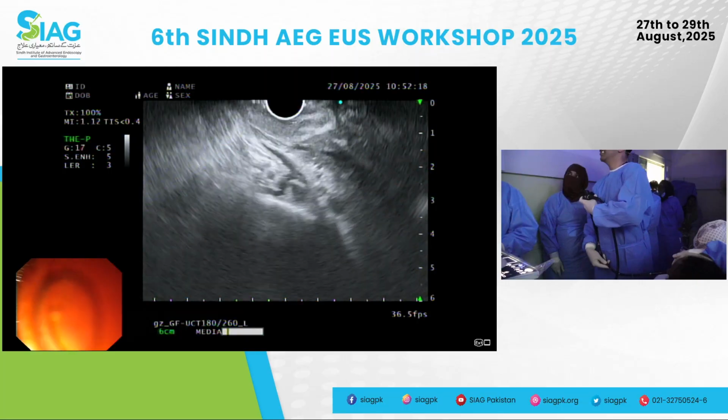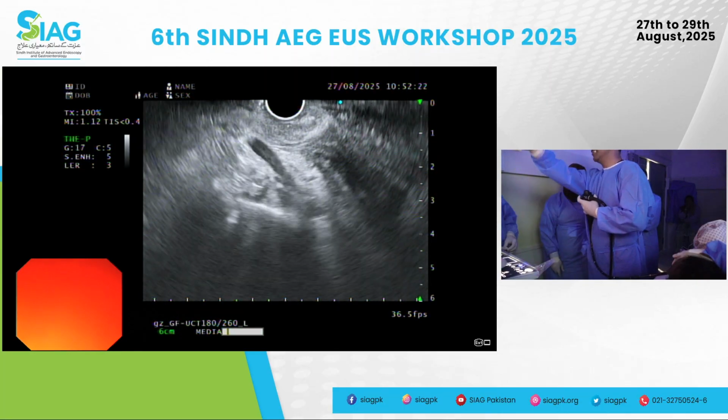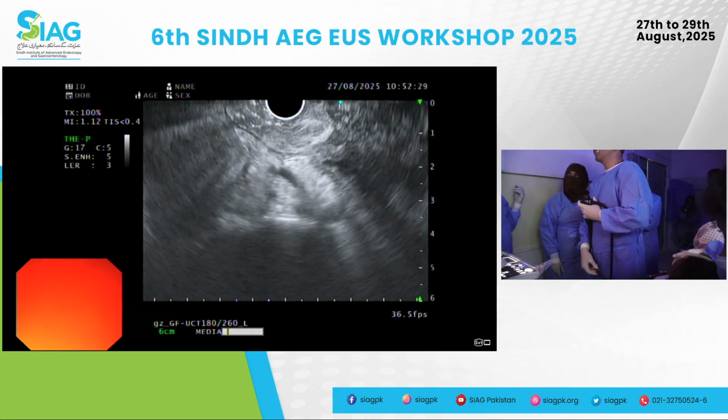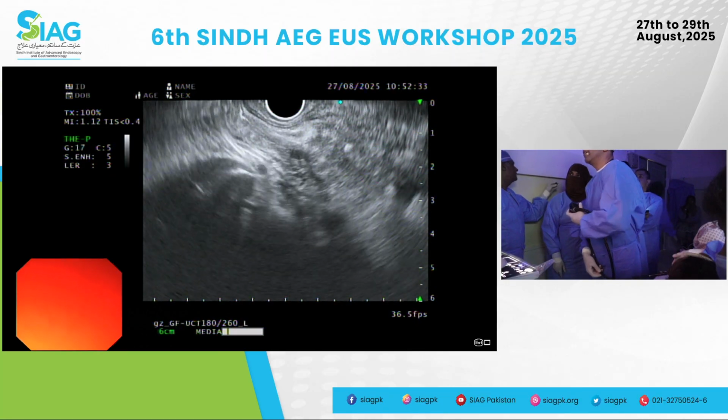So you start to see the pancreatic parenchyma at that stage there. And I'm compressing the IVC as you see it there. Because I'm trying to overcompensate, we didn't want to fall back in again. And I think the Doppler please.